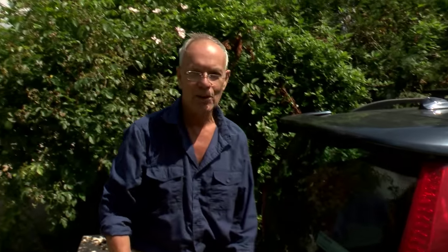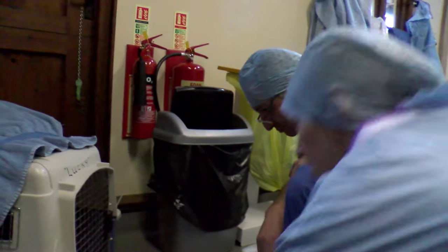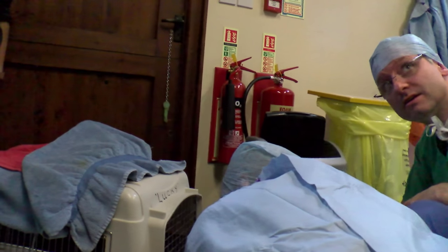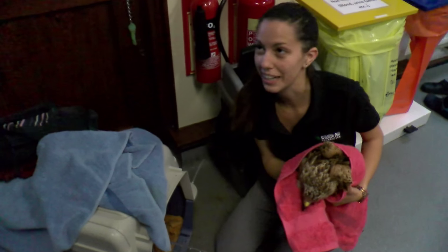And now comes a dodgy bit when I take the camera. I'm bright — how do you turn this off? That looks pretty flat out. They play dead, don't they? Yeah, we have a red kite. It's not dead, it's playing dead. But he's fine.